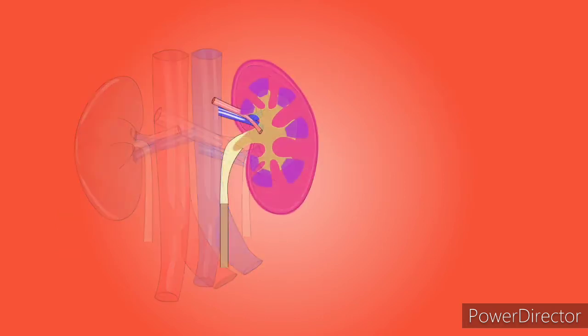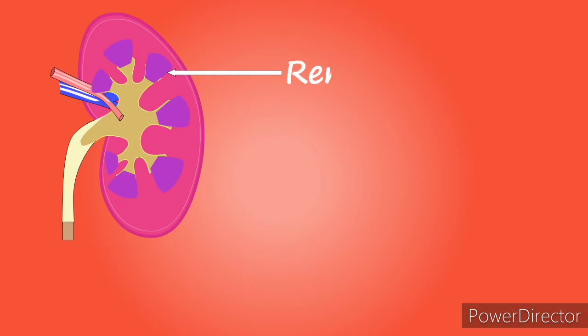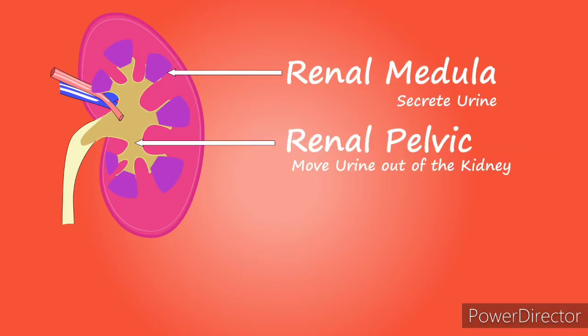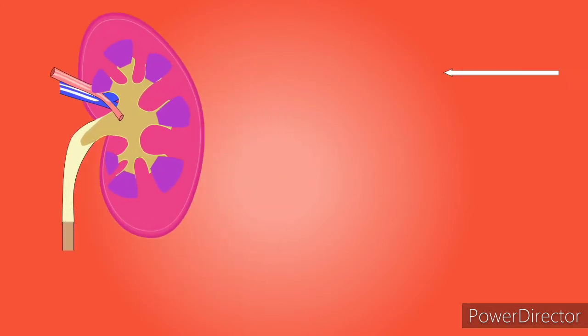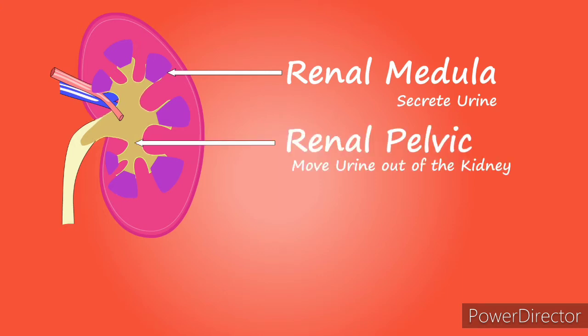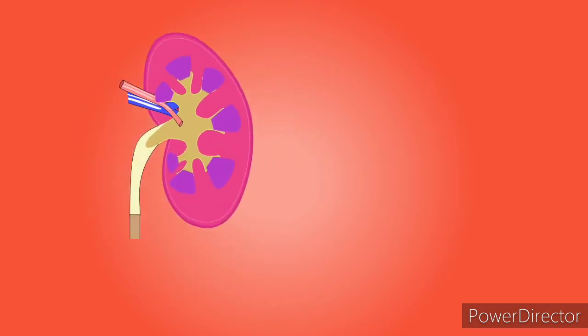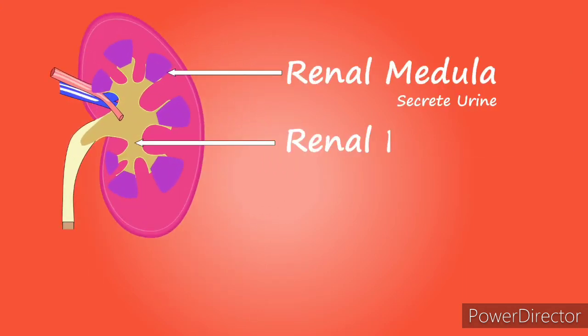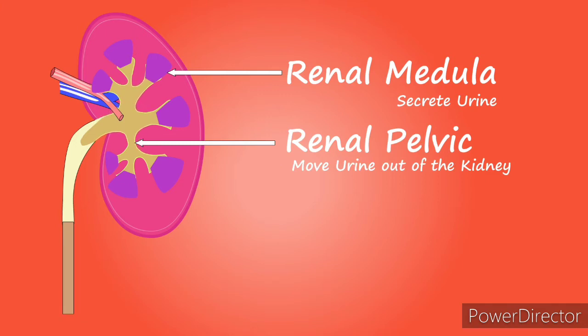So the composition of this urine varies from day to day depending on the food we eat and the fluid intake. So that is what determines the volume of urine we pass through in a day. So for this urine analysis, if you are to do this test, the urine sample should be collected in a chemically clean and dry container.